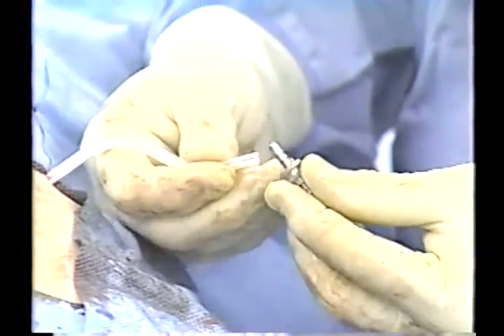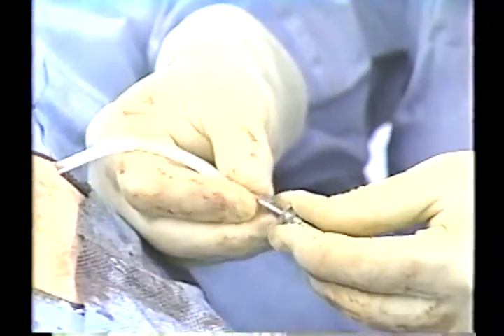A sterile connector and patient line is attached to the newly implanted catheter.